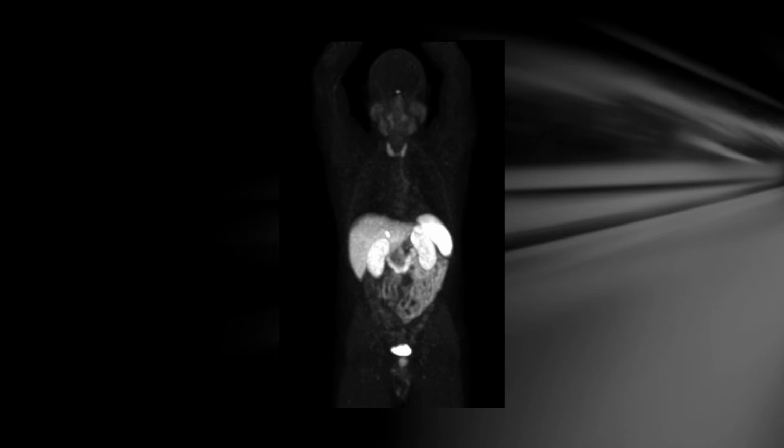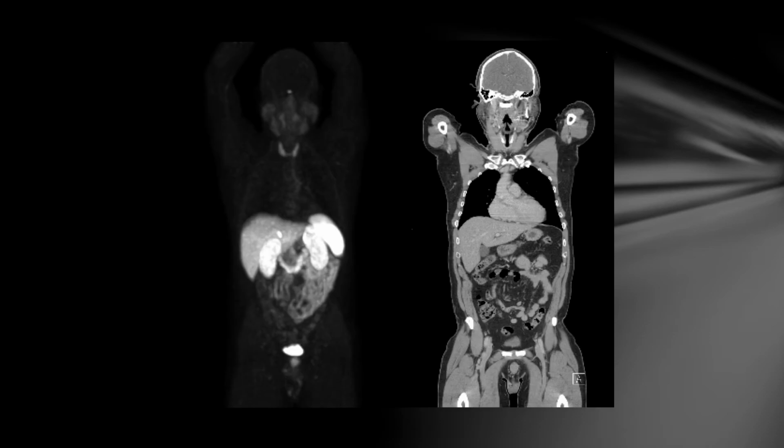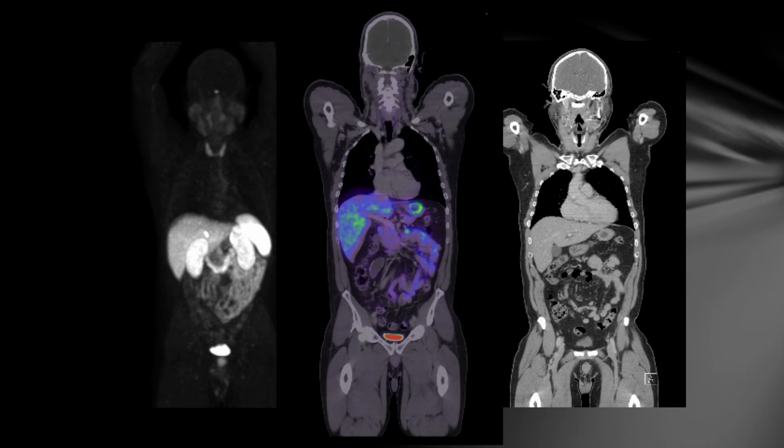Each PET-CT study produces thousands of images, which is why you might wonder why it takes so long to do a report. For a start, we have to wait for the images to come through, and then literally each study will produce 2,000 images. All of our studies are reported by a radiologist, and then double read by another radiologist to try and make sure that we're as accurate as possible. We produce both PET images and CT images, and this allows us to create fused images, which gives us great anatomic correlation.